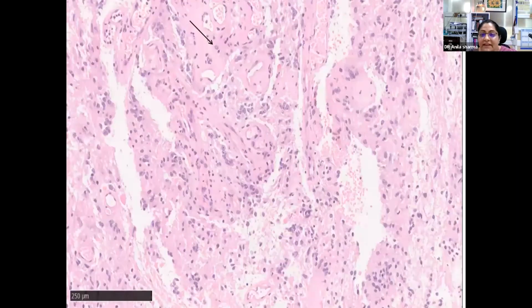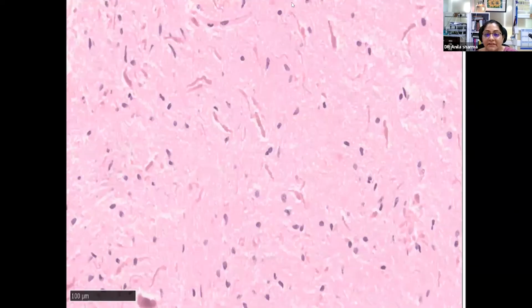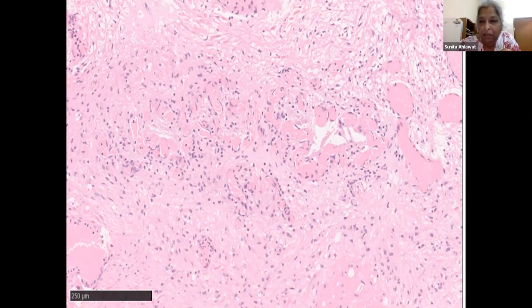This is again a classical pilocytic, with lots of hyalinization around the vessels, and it's a pink tumor. These are the eosinophilic bodies. The tumor had a predominance of the Rosenthal fibers and the EGBs. And these are the pretty-looking Rosenthal fibers. I think in this slide we had more than we've seen in the book put together. And this is again the Rosenthal fibers. The increased vasculature is in a linear pattern, or they form chains. So this is classical of a pilocytic astrocytoma. This is called the garland pattern, and this is very characteristic of pilocytic astrocytoma.